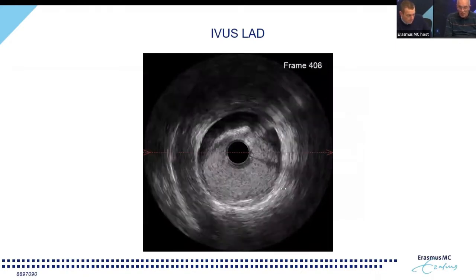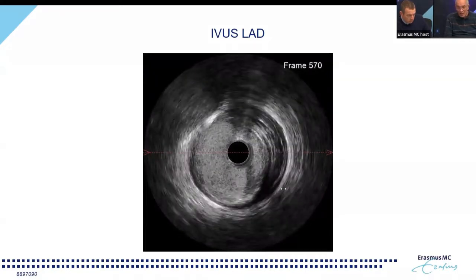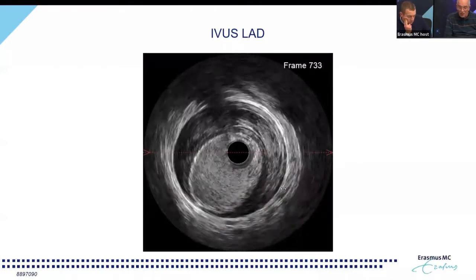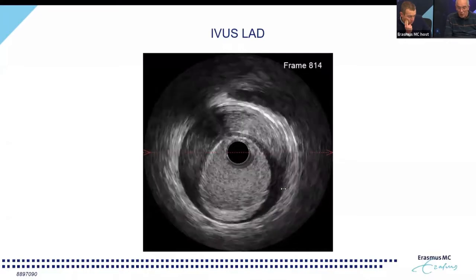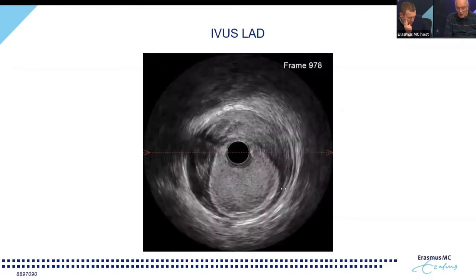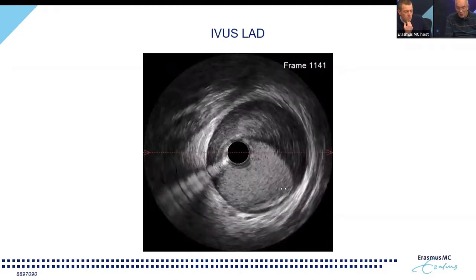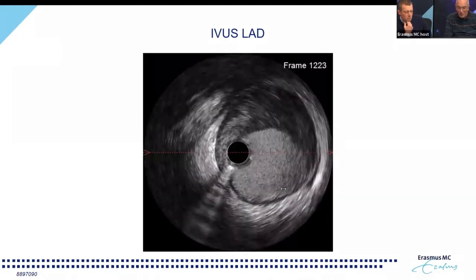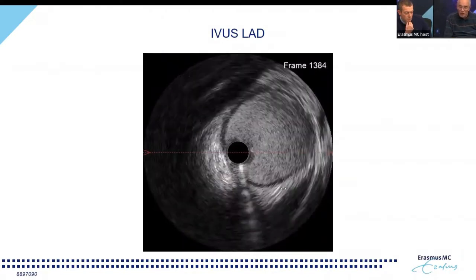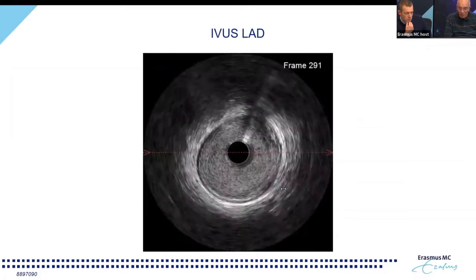So we see some disease, but immediately we see again a huge hematoma, and we see actually not that much disease in the vessel itself. And you see that the hematoma is continuing and continuing. Submedial or subintimal? It's submedial because again, you can appreciate the media and it's blowing up again. You see it, but it doesn't compress the lumen that severely. And here, an important point, we saw a loose flap with an opening in there.